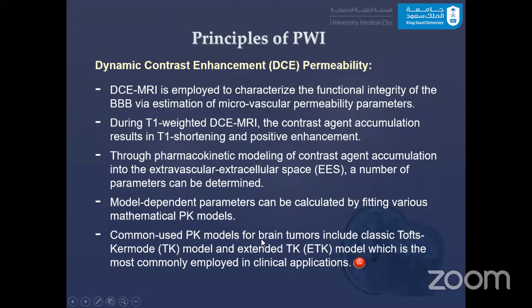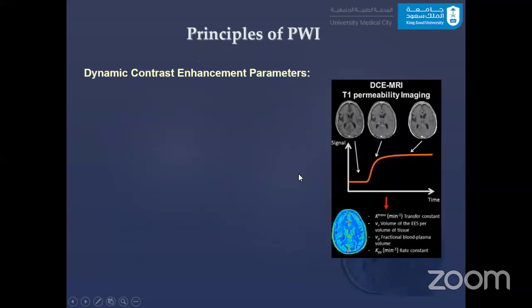Dynamic contrast enhancement is used in areas outside the brain, such as the prostate. It has an application recently in the breast and other body parts. But in the brain it is not as common as susceptibility. Recently, it has had a good number of applications, and it's increasing. I mean, using this technique in brain imaging is finding its way. The limitation is the limited software to do the post-processing for dynamic contrast enhancement.